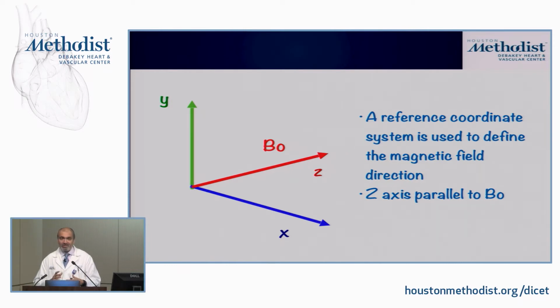So this is basically an X, Y, and Z coordinate system within the scanner itself, and that allows the ability to do tomographic imaging, which means that we're not just picking arbitrary planes, but we can pick sequential planes however we want.